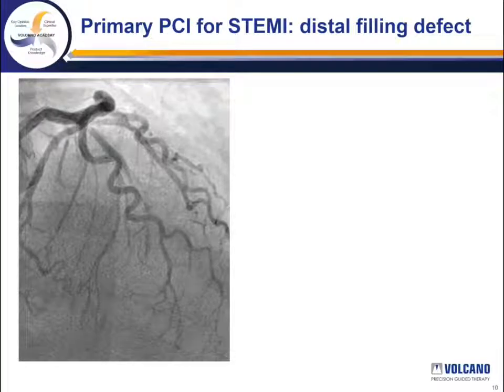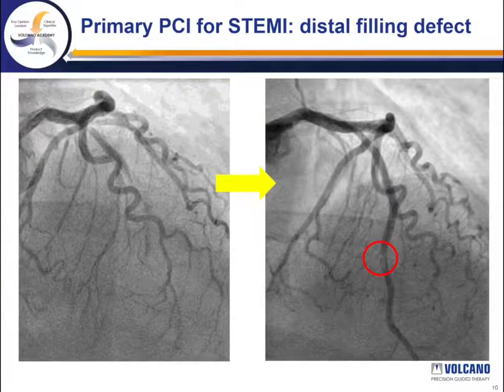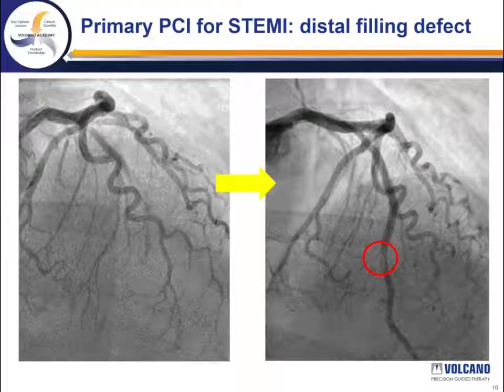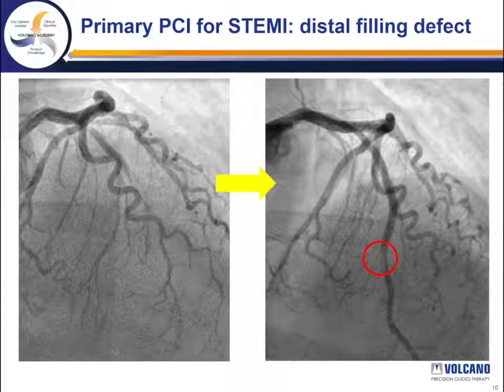Here's another case during a primary PCI for an ST-segment elevation myocardial infarction. The original picture shows the occluded mid left anterior descending. After this is opened and stented, there is a filling defect distally. Often these are just subject to another balloon dilatation or even stenting. However, IVUS can help determine the actual etiology and more appropriately guide therapy.